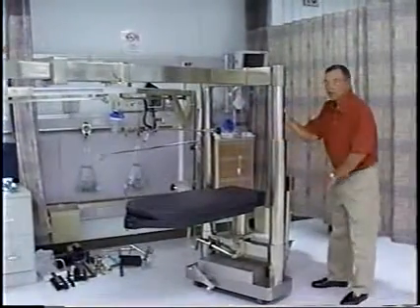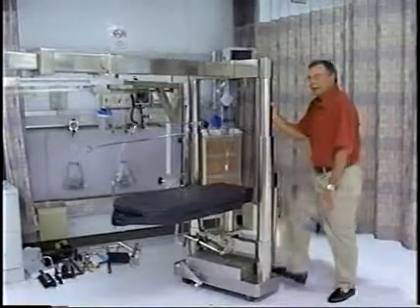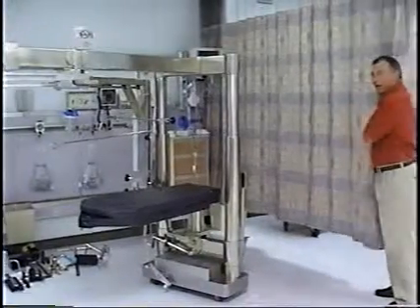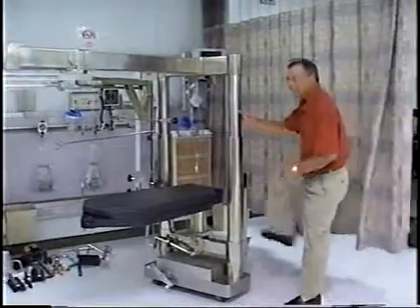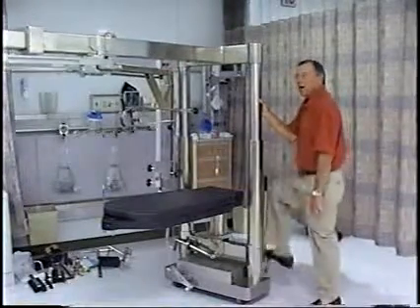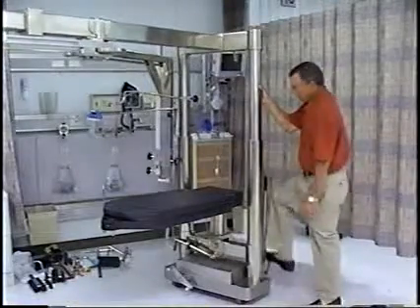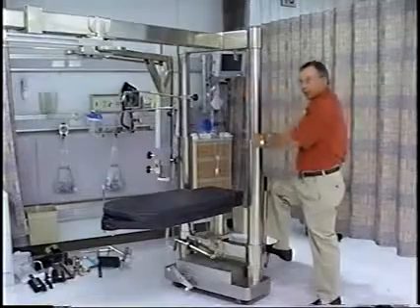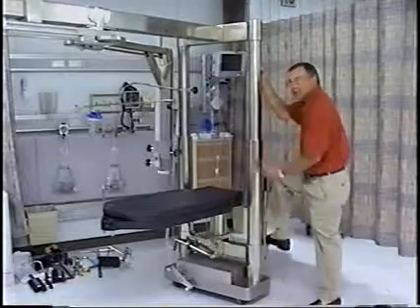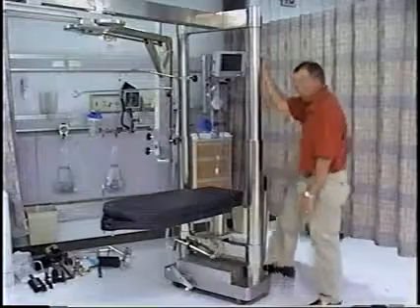Down at the head end of the table, there's a foot pedal. And this is where you get your aerobic exercise. This is not powered. Our new table is powered. Okay? A little commercial there, Aim. This goes all the way up. You'll notice that this is a two-stage pump. Right now just these lifting collars are going. When it gets to a certain point, the top itself will start going up. When you get to that point, you stop.